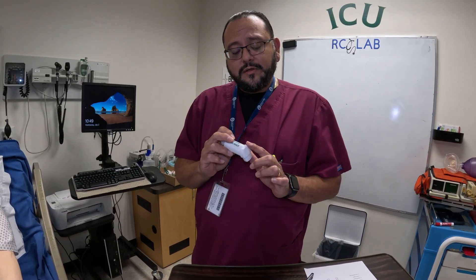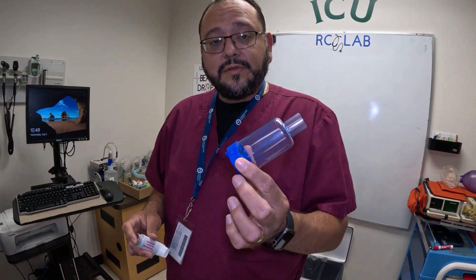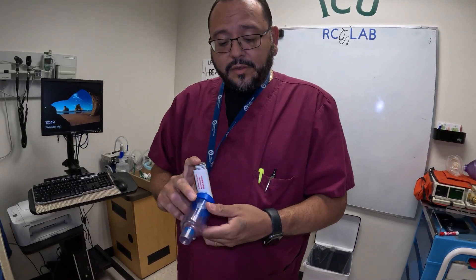Some of these come with counters. There may be a counter here that tells you it may be 200 doses or whatever the dose is. Know that it might not count down by one — it might be 200, then 150, then 100, and so on until it's almost empty. We always recommend using a spacer. There are different kinds; this is the one we're going to use. There's a one-way valve in there. Any of the L-shaped medications like this should work on here — so this goes in here.